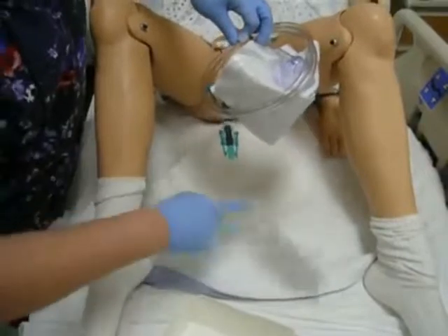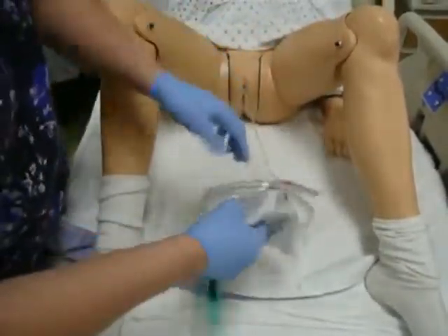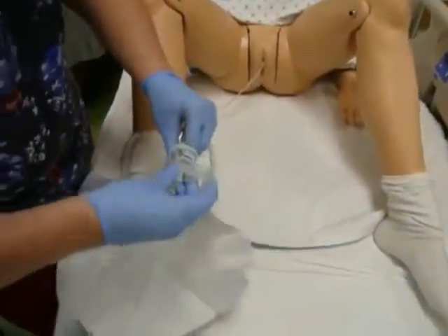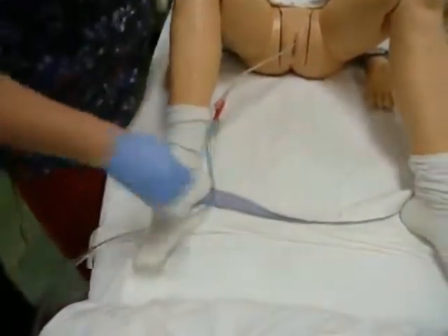Move this down, get rid of my garbage here. The catheter will hang on a non-movable part of the bed — there's usually a cath holder off the end of the bed, which you probably won't see.